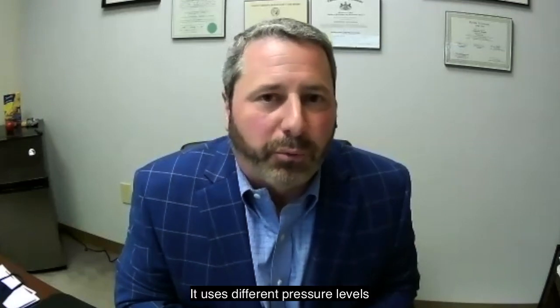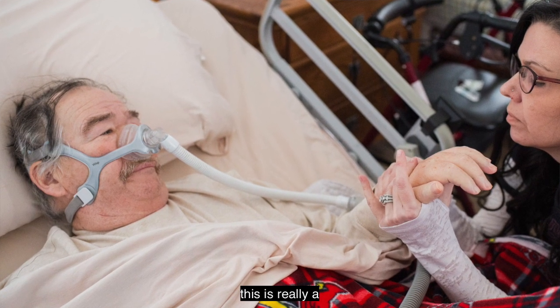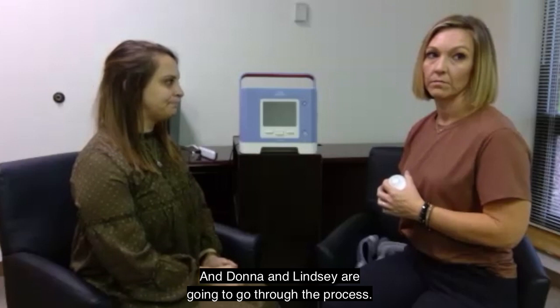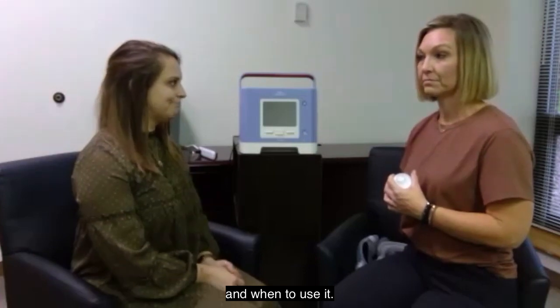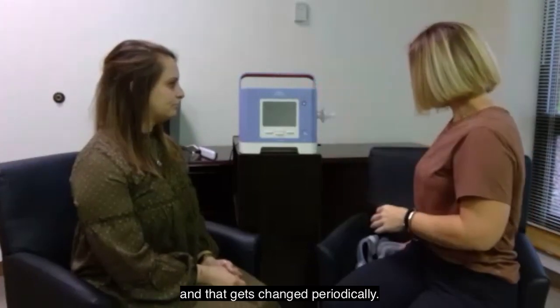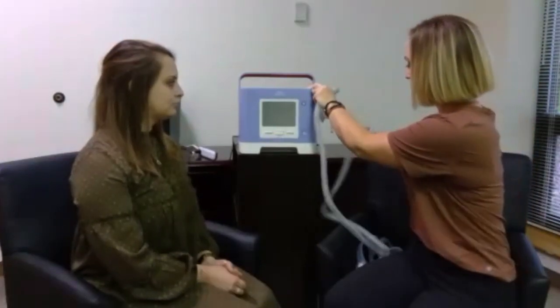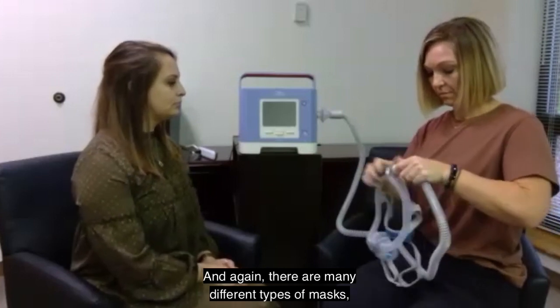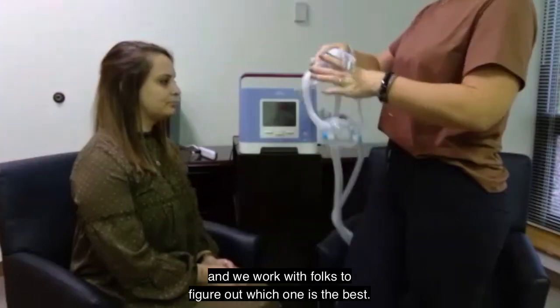It uses different pressure levels when you breathe in and breathe out. This is really a demo setup of it here, and Donna and Lindsay are going to go through the process. Once we've educated somebody about how, why, and when to use it, the basic setup goes as follows: we connect the air filter to the side of the device first, and that gets changed periodically. Then we connect the patient tubing. From there, we connect whatever mask has been selected for the patient. There are many different types of masks, multiple sizes of each type, and we work with folks to figure out which one is best.